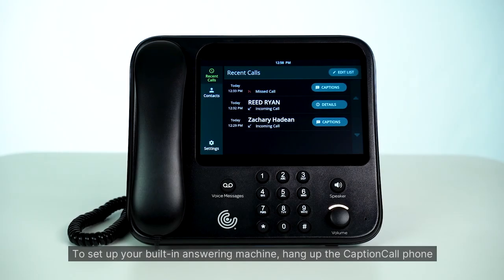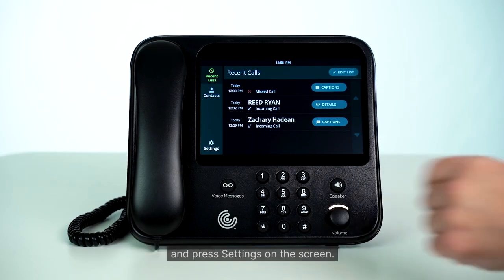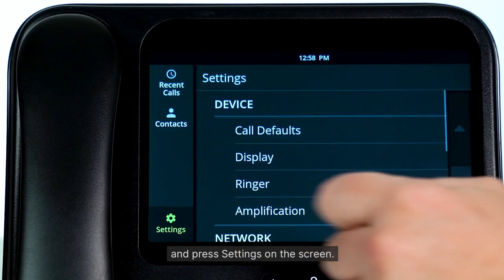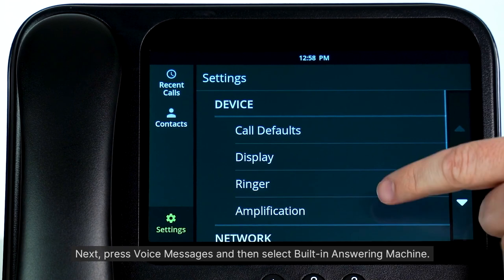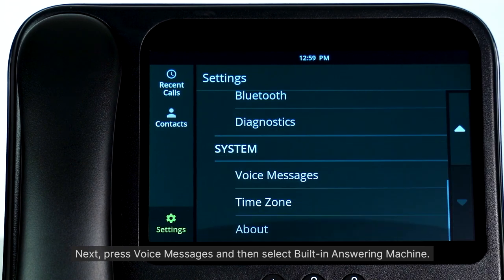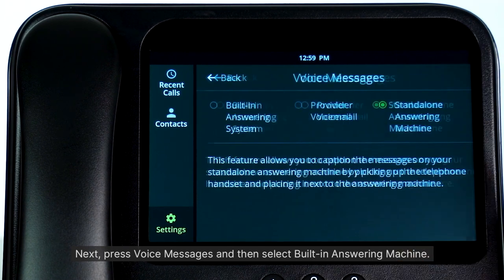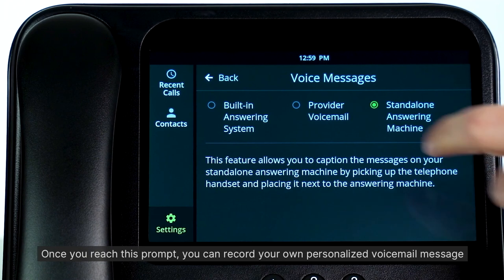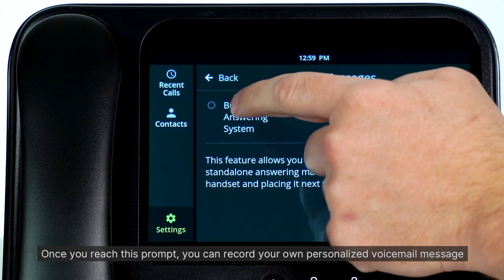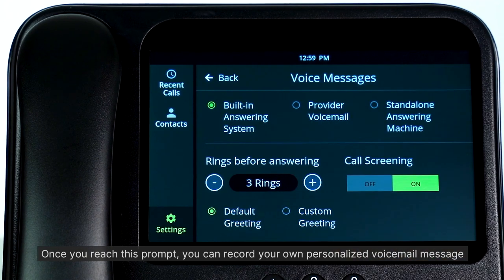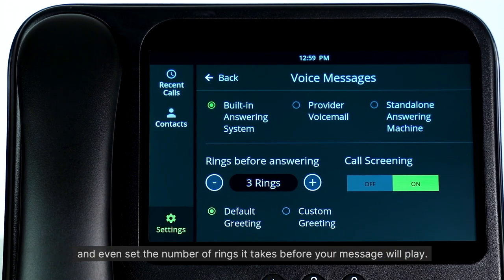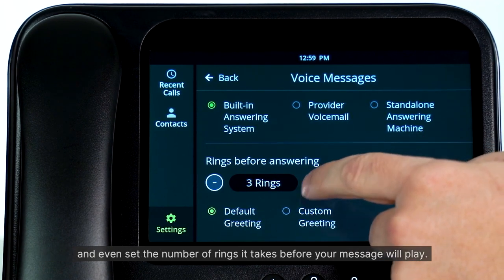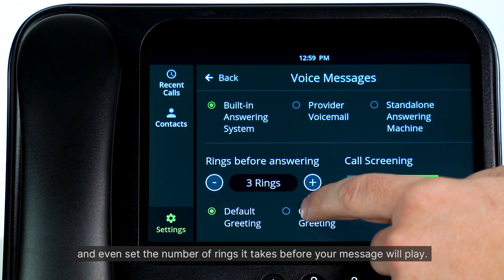To set up your built-in answering machine, hang up the CaptionCall phone and press Settings on the screen. Next, press Voice Messages and then select Built-in Answering Machine. Once you reach this prompt, you can record your own personalized voicemail message and even set up the number of rings it takes before your message will play.